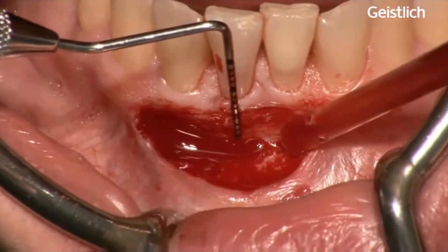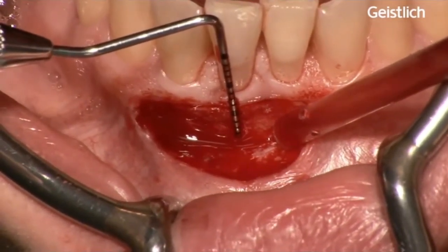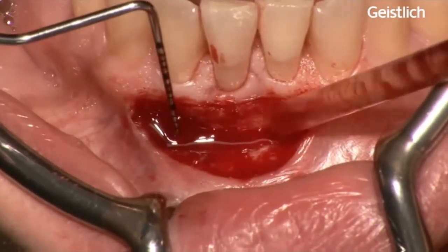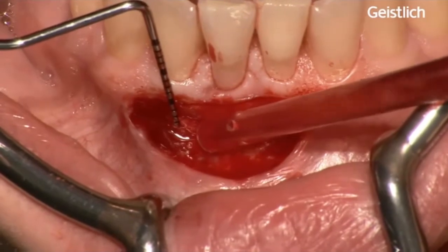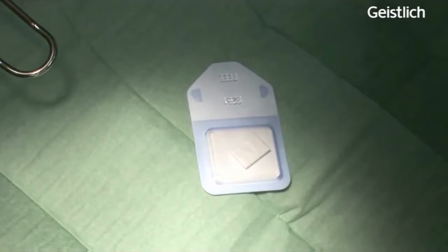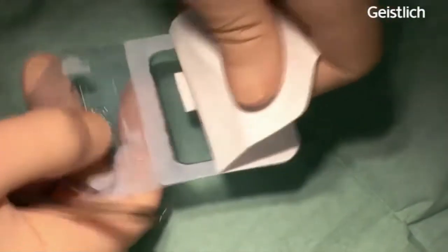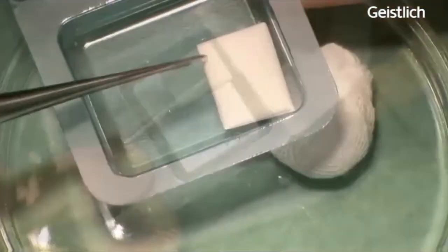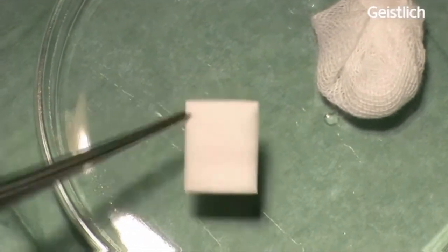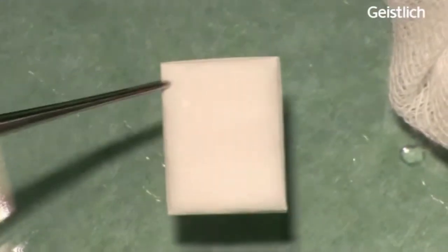Precise trimming of mucograft is important to avoid tension when suturing the device. The sterile double-packed mucograft package is opened, the matrix transferred to a sterile tray and trimmed to the appropriate size in dry state. Mucograft is a three-dimensional collagen matrix of porcine origin serving as a soft tissue substitute.